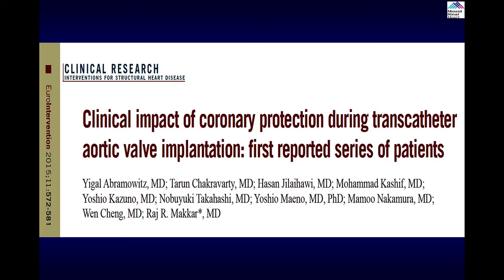Now, very important, and this is actually interesting, a technique really propagated by Raj Makkar, and we learned it because of one of our cases 2 years ago in a live symposium, and we have done it. If you know that you could have coronary obstruction, particularly left main, identified based on the criteria which we have talked about, left main height less than 12 millimeter and sinus of Valsalva less than 30 millimeter, you can use the preemptive technique.